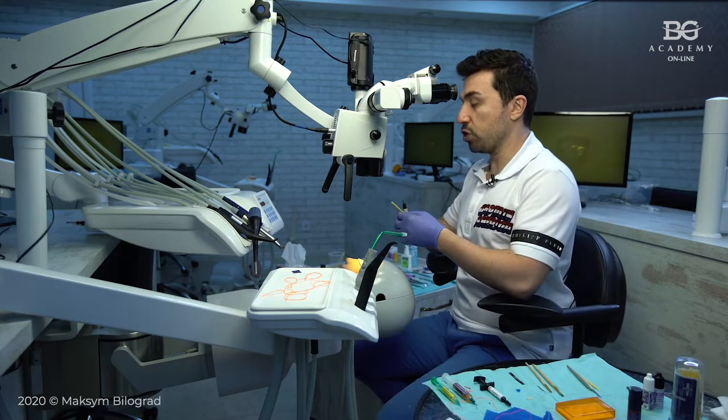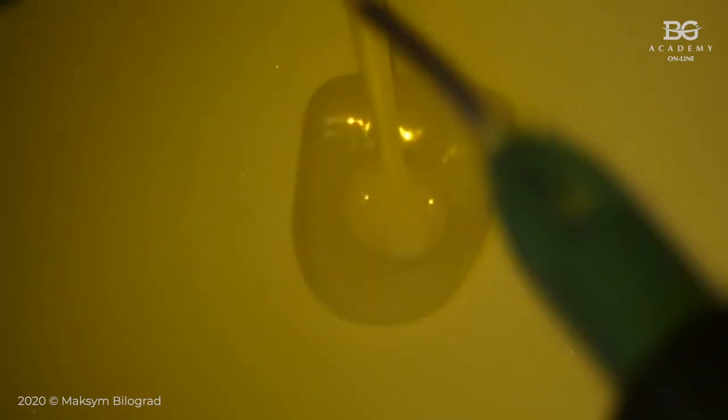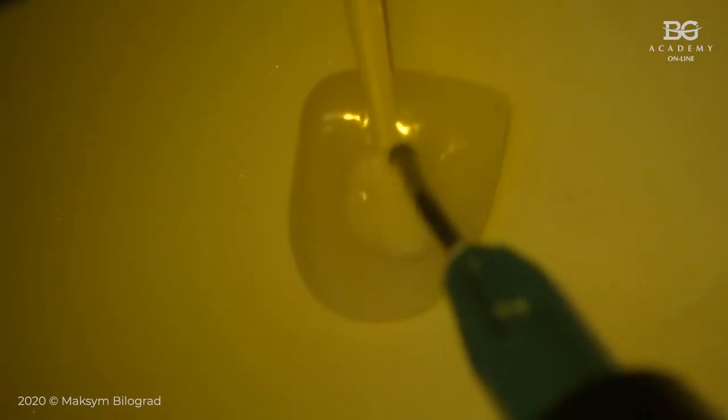We will use just flowable, the cheap flowable composite. You just make some drop of the flow here. Okay, you put a micro brush, you light cure, okay, and you have a really simple, really cheap and really efficient holder for your veneer.